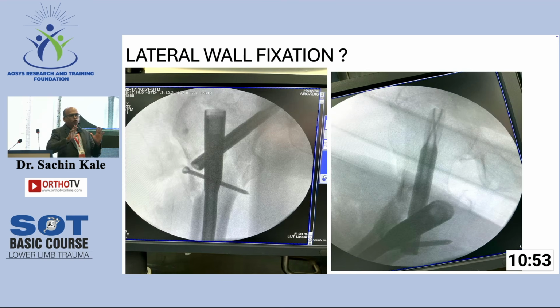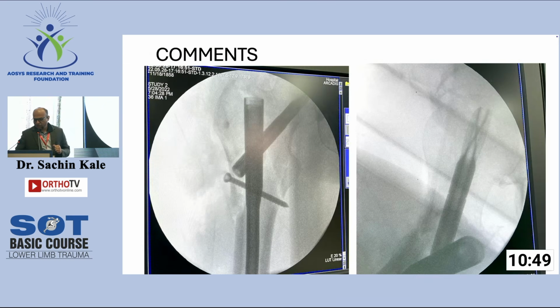Yeah, so you want a more rigid fixation there because you feel it is unstable. Definitely. Okay, very nice. So that's what was there. It was looking, but again, what you said, absolutely, the bolt was not holding that thing.